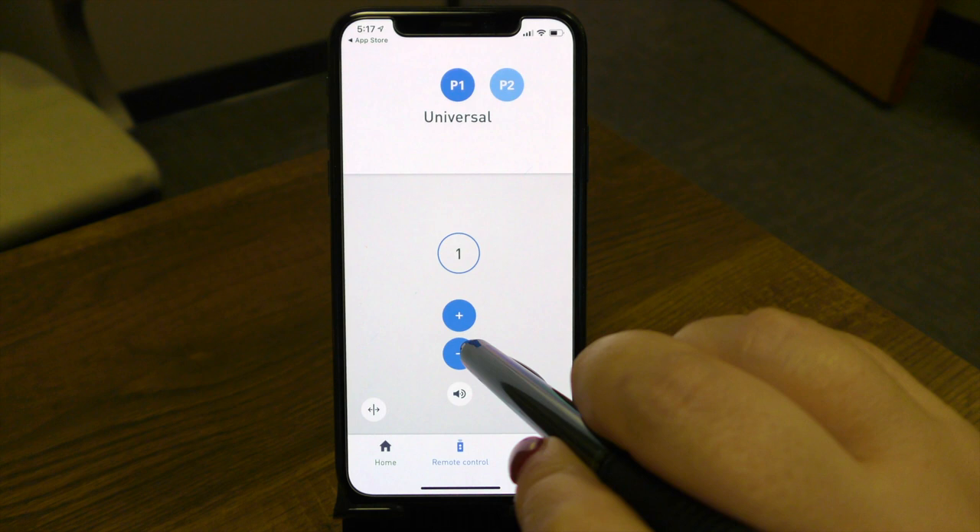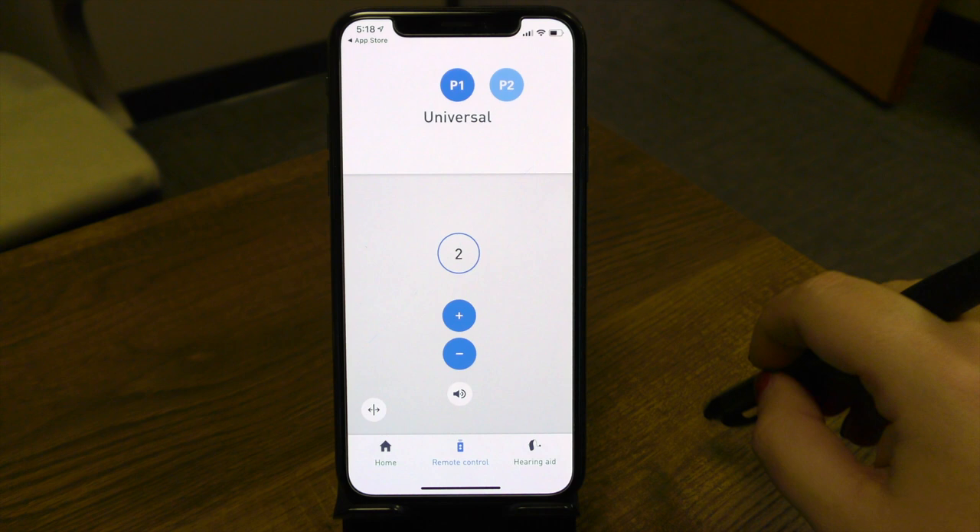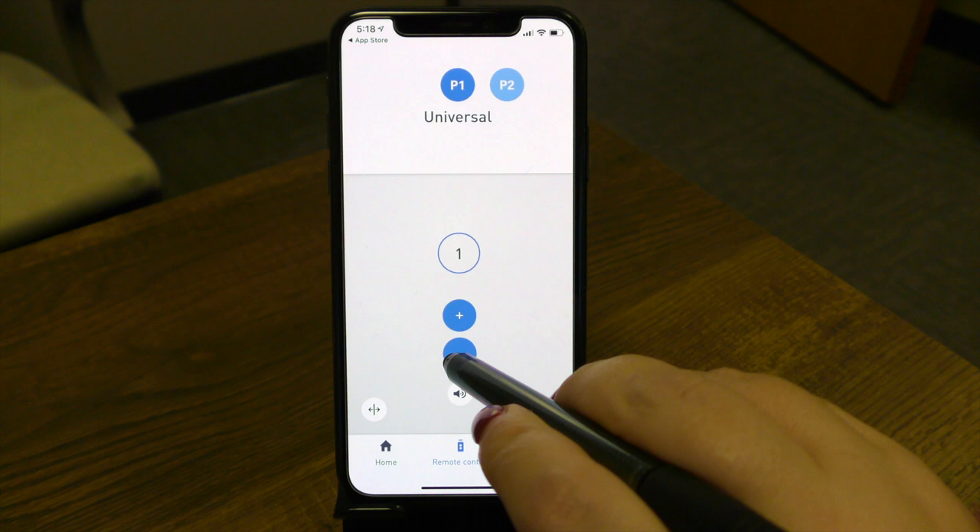As I press and increase the volume, notice we start climbing. You will hear sounds in your hearing devices letting you know that you're manipulating the device, giving you an indication that the command is being accepted. As I turn it back down, notice it comes down to zero.